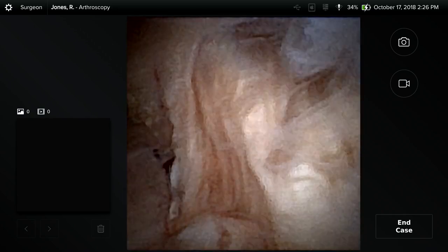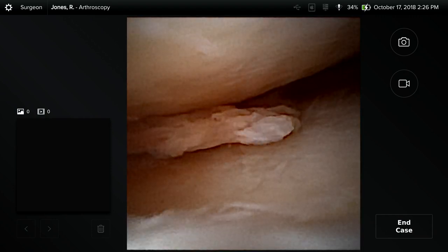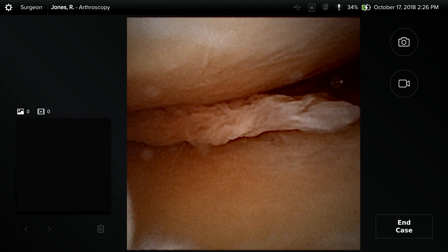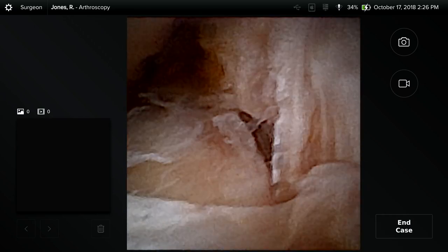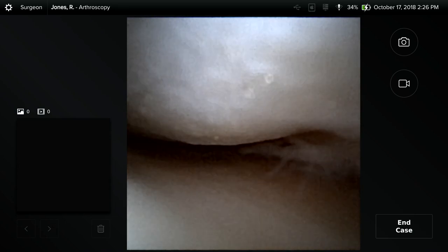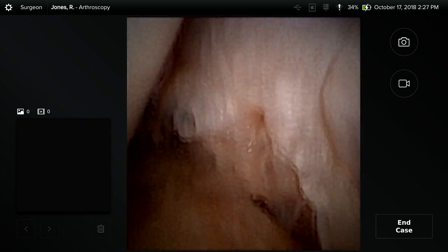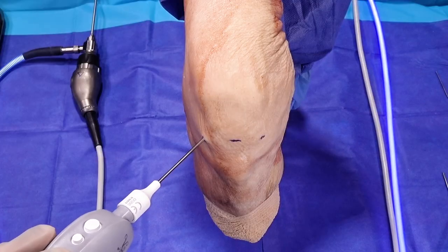Entering from a lateral portal you get this broad perspective — you can actually see a meniscus tear in the lateral compartment there, trapped inside the joint. You can pan across, there's our ligamentum, and we can work across that and underneath it and even get into the medial compartment of the knee. So it really gives us a broad view, and this is without a second portal and without really any manipulation of the knee.